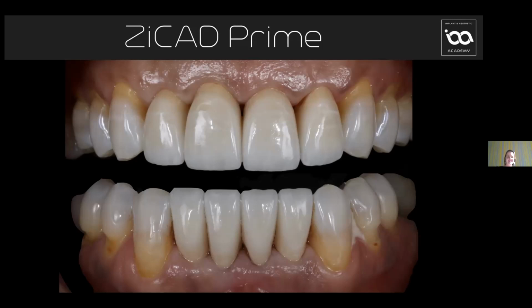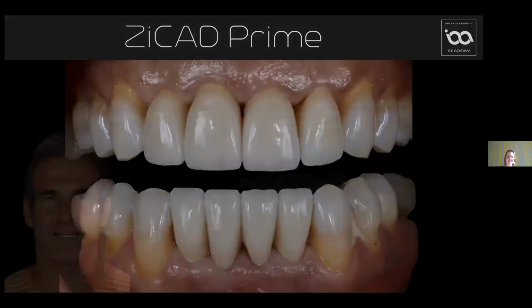And we used to have to use, obviously, lithium disilicate type restorations, and then provide horizontal preparation. So this combination of having materials which we can mill into feather edge, which are biocompatible subgingivally, and have these beautiful aesthetic outcomes, really has opened the door to these new techniques that we're talking about today.